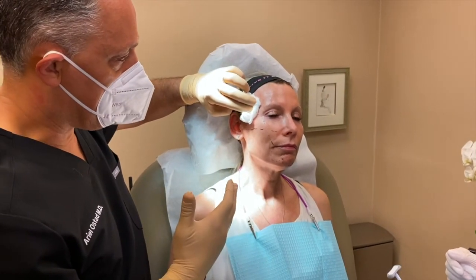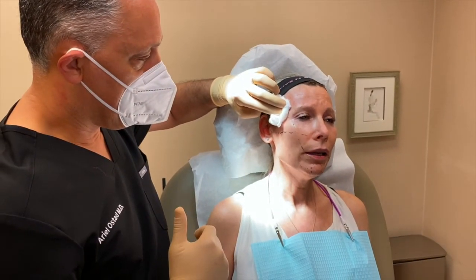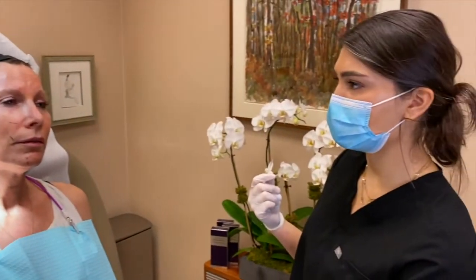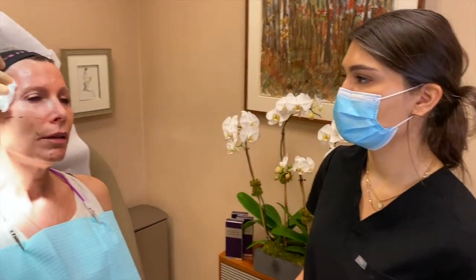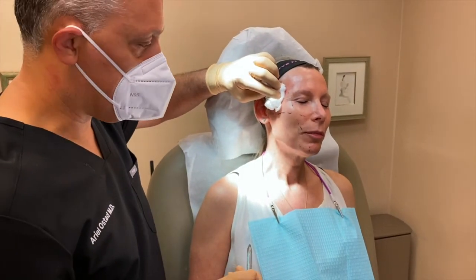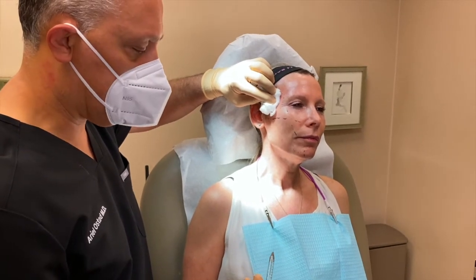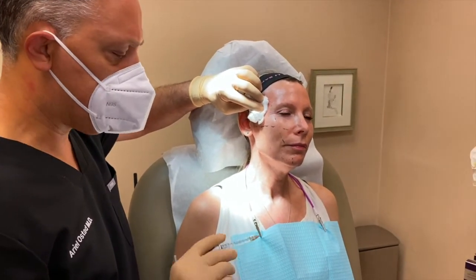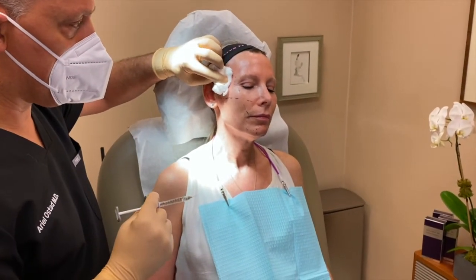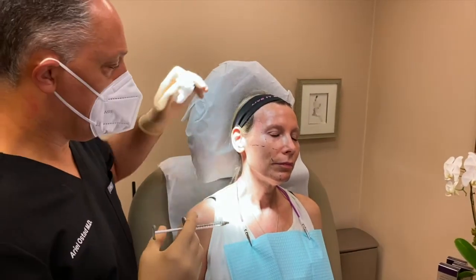How was that pain on a scale of 1 to 10, like 10 being the worst pain? Like a 3. Okay. It was no big deal. Do you feel the numbing happening on the other side? Yeah. All right. I really appreciate your candor, your honesty. I want people who are watching this to be able to get a feel for what these needles feel like. These are tiny needles. I'm sorry, this is a 27 gauge needle actually for the purpose of injecting Voluma. So they're tiny, and it's all about injecting slowly.